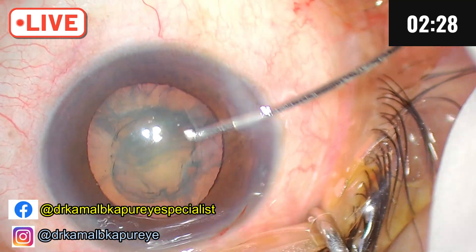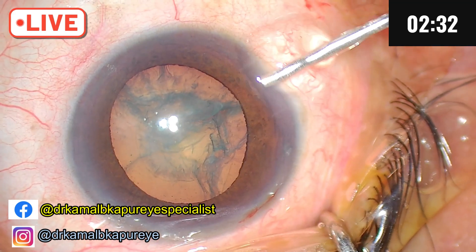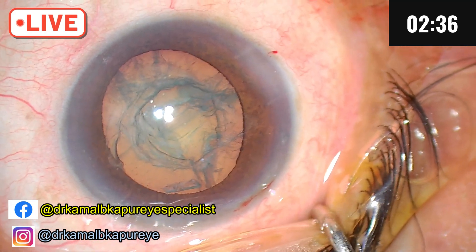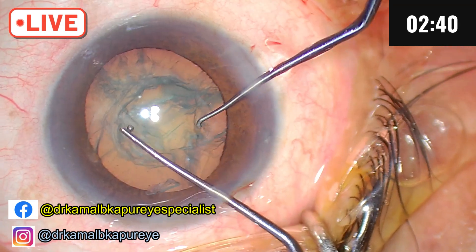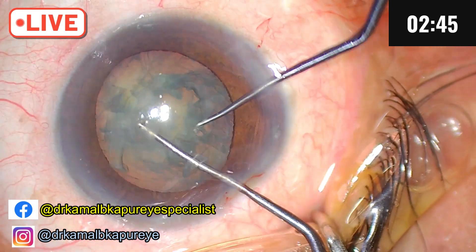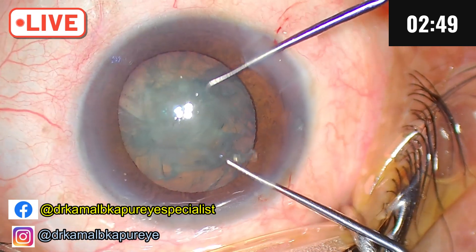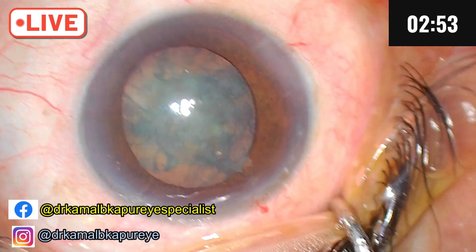So we have to add visco. Since my rhexis is small and the chamber is shallow, I'll do a bimanual rotation of the nucleus. Use a Sinski and a Leicester's manipulator and see if we can rotate — yes, we can. The endeavor is to shorten the surgical process and also have a reduced intraocular pressure during surgery.